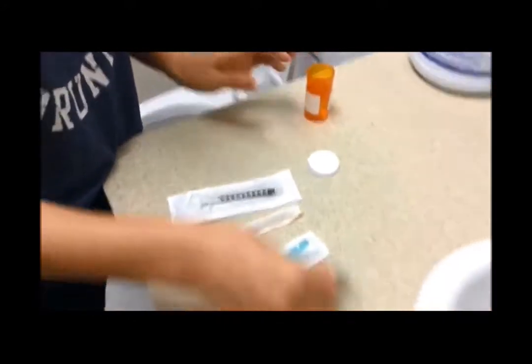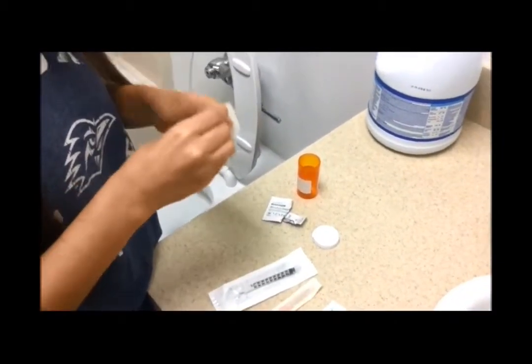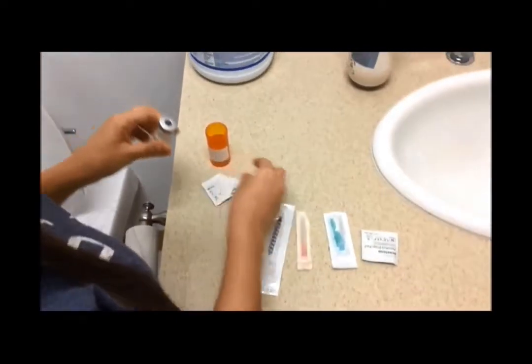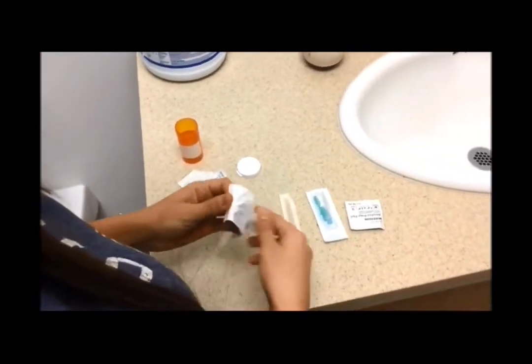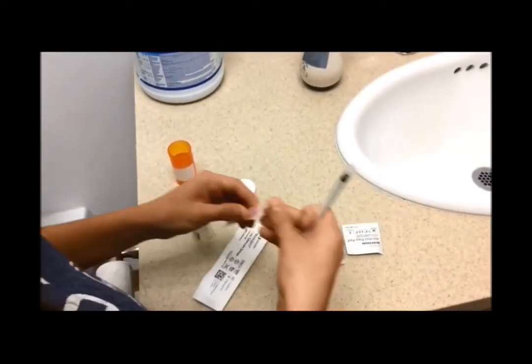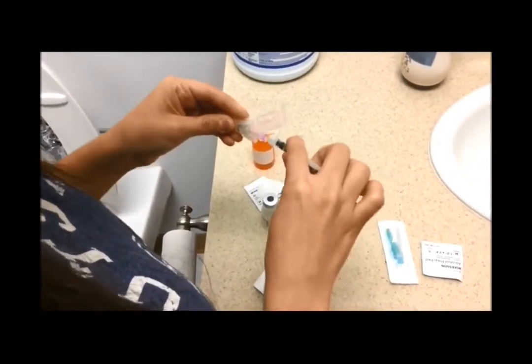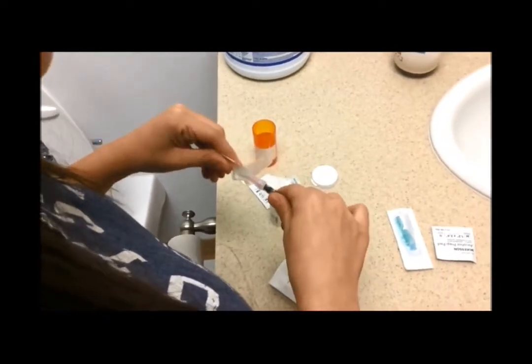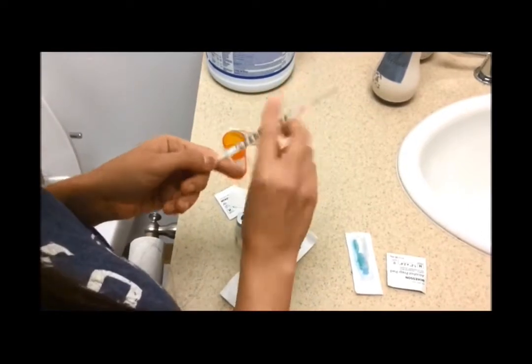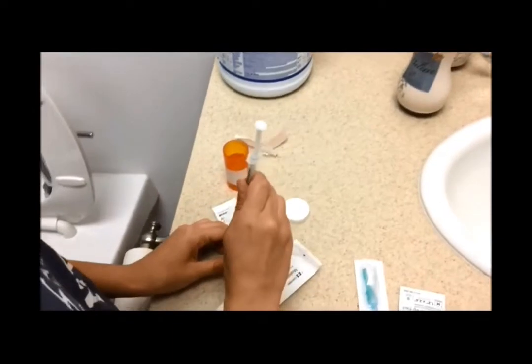You are now ready to draw up your medication. To draw up, first you will need to scrub the vial hub with alcohol for 30 seconds. Then, connect your 1 milliliter syringe to the 18 gauge fill needle. This is the thicker of your two needles. Then draw back air into the syringe to your correct dose by making sure the end of the black stopper is at the appropriate marked line. This patient's dose is 50 milligrams of testosterone cypionate, so he will draw up 0.5 milliliters of medication.